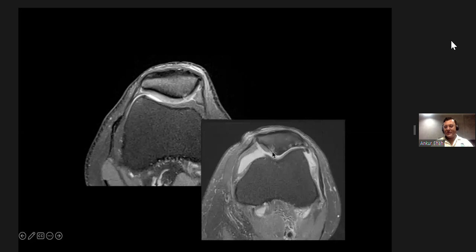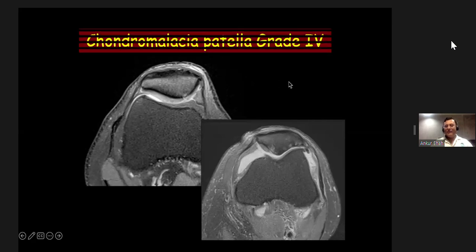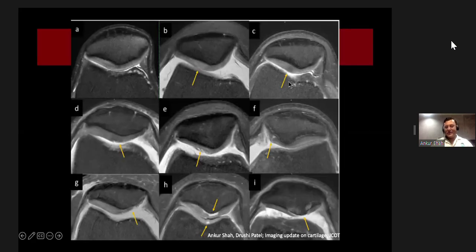the subchondral bony changes. If it is extensive like here, it is easier to detect, whether it is full thickness loss of cartilage in the larger area, the lateral facet, part of medial facet with multiple bony changes. But when these changes are very subtle, it might be easily missed on the first look of MR, and we need to look carefully for these changes.